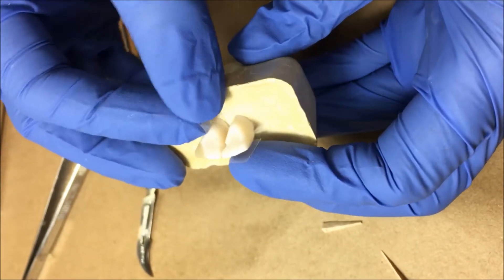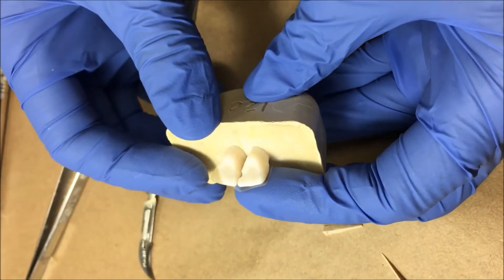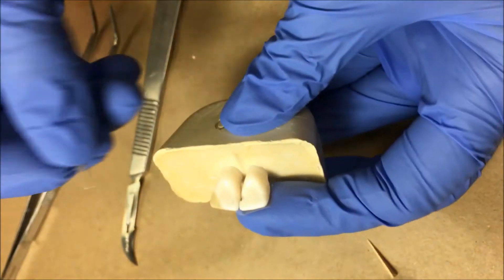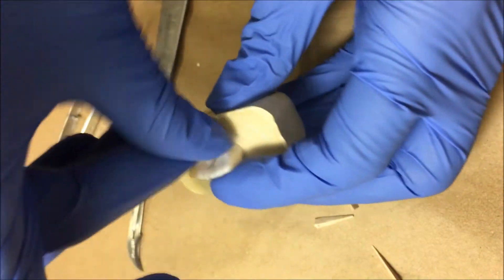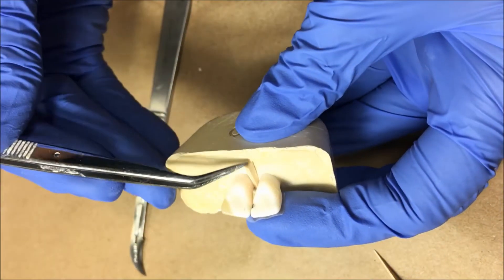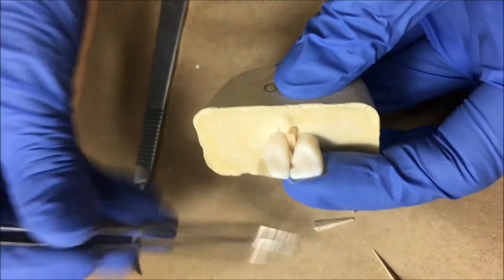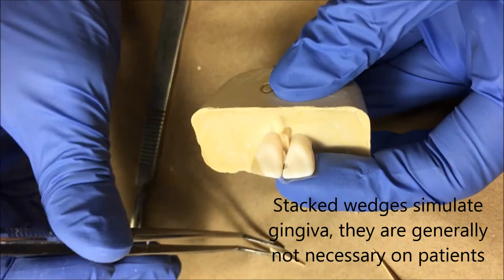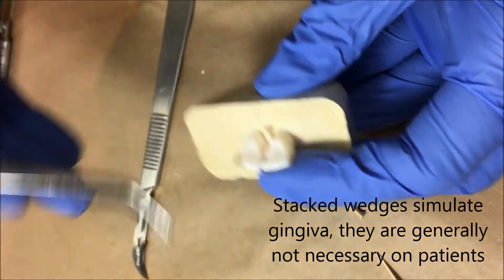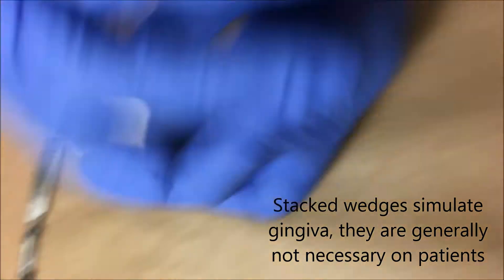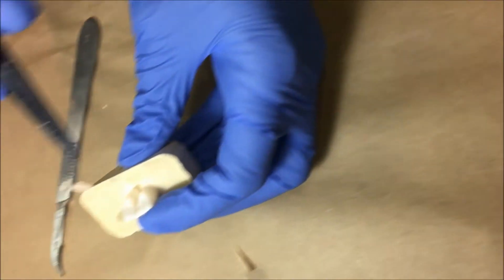When you're working on a stone block make sure you kind of half it about there. You're going to have to stack your wedges. Doesn't really matter which direction that one on the bottom is going. All you're doing is stacking.